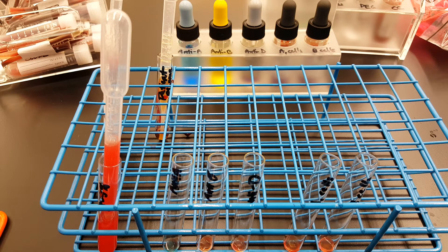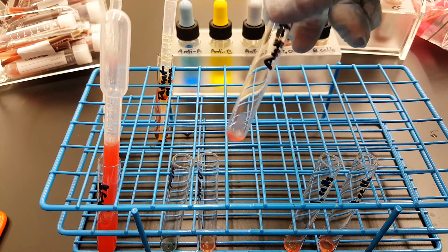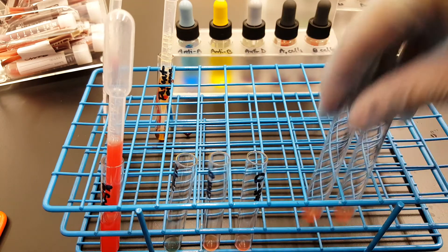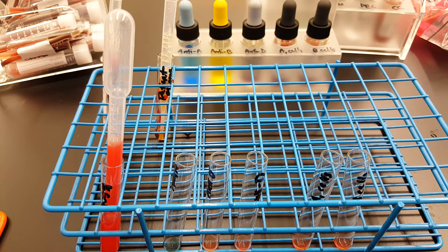So once you have that done, you're going to kind of shake them around a little bit, not too vigorously, and we're going to put them in the centrifuge and spin them for 15 seconds so that we can get the red cells and the antibodies to agglutinate—the antigens on the red cell and the antibodies to agglutinate—and that way we can form a button. We're going to shake it gently to try to break it apart, and we're going to judge the reaction strength.